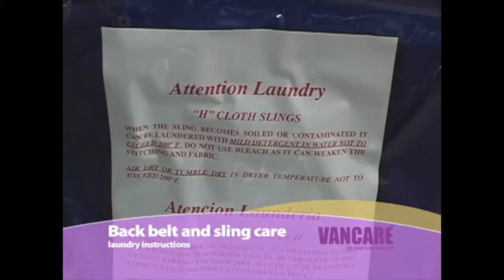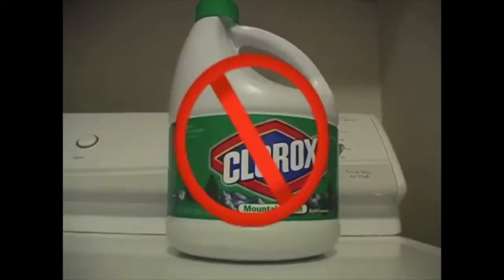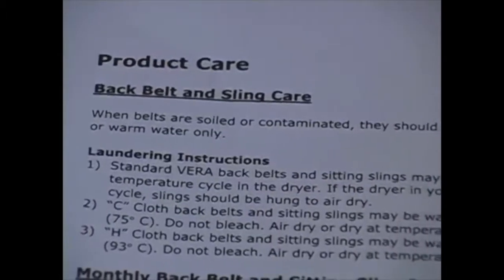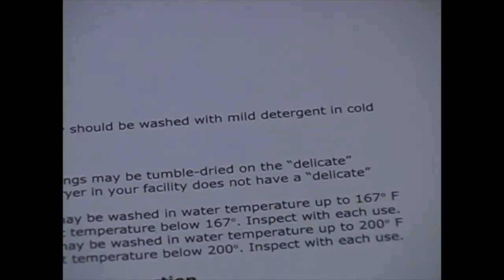Care instructions. Back belt and sling care laundry instructions: When back belts and slings are soiled or contaminated, they should be laundered with mild detergent in cold or warm water only. Do not use bleach as it can weaken the stitching and fabric. Slings may be tumble dried in the dryer on the delicate temperature cycle. If your facility's dryer does not have a delicate cycle, slings should be hung to air dry as heat will damage the padding and the slings. It is important that the nursing and laundry departments are instructed to care for the slings correctly.